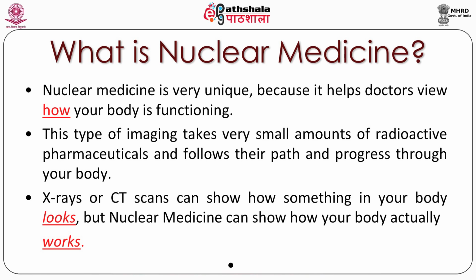This type of imaging takes a very small amount of radiopharmaceutical and follows its path and progress through your body. It means this radiopharmaceutical acts like a tracer. When you inject or administer it, it goes into the body, mixes with the blood, and finally the pharmaceutical takes that radioactive material to the place of choice where you are going to diagnose that particular organ.